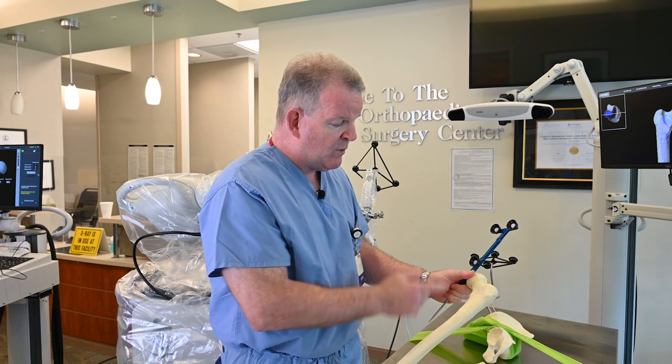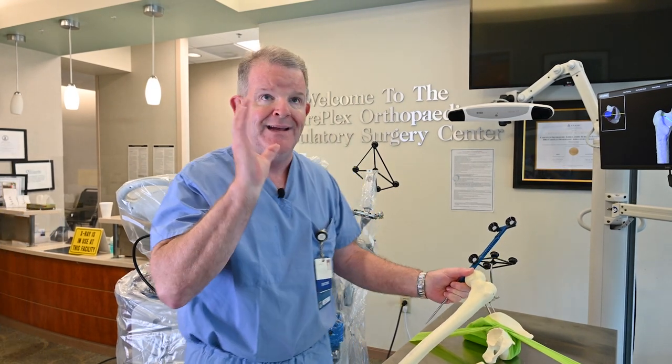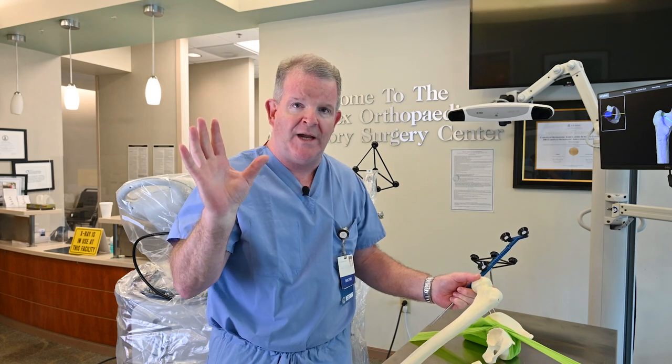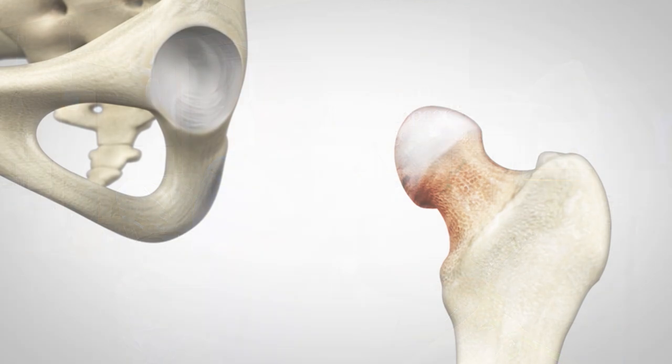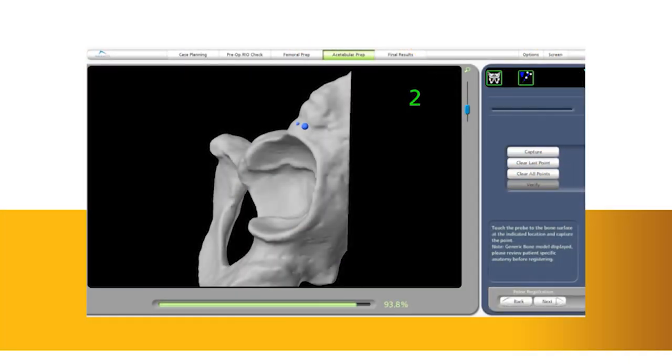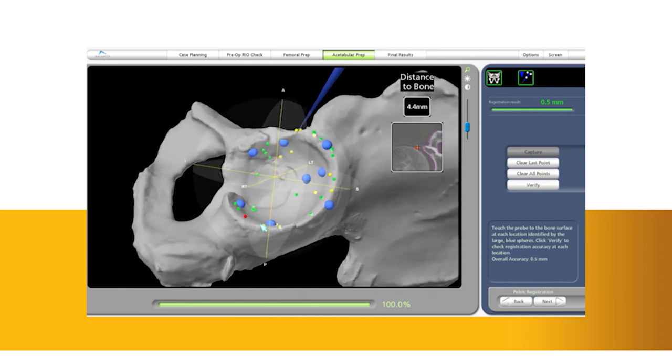When I used to do it without the robot, I would kind of guesstimate based on my plain film x-ray, a two-dimensional image, not a three-dimensional image. We now have this three-dimensional image, and we get it much more precisely. That does impact leg length when you make the femoral neck cut.